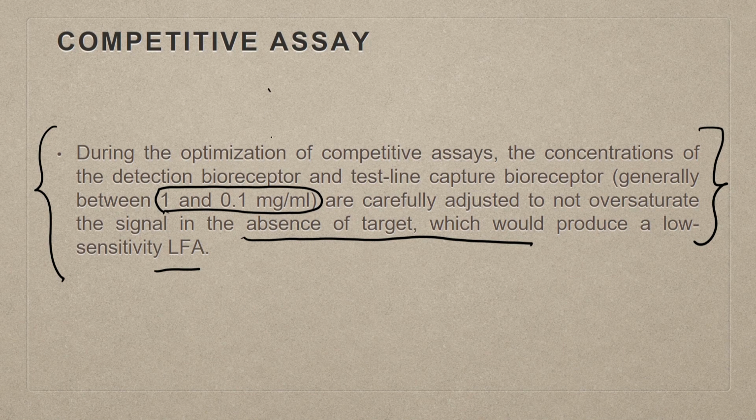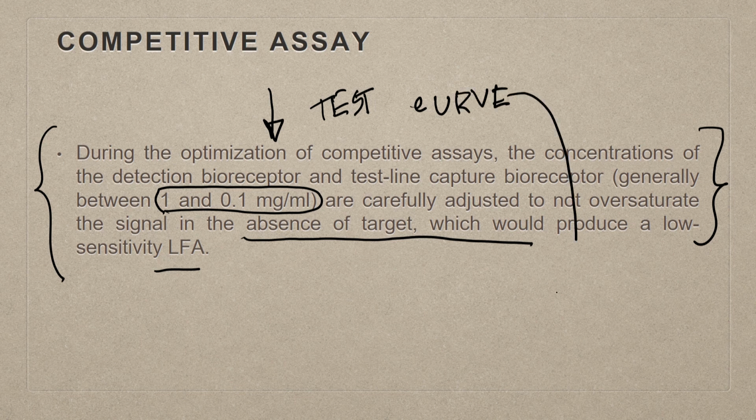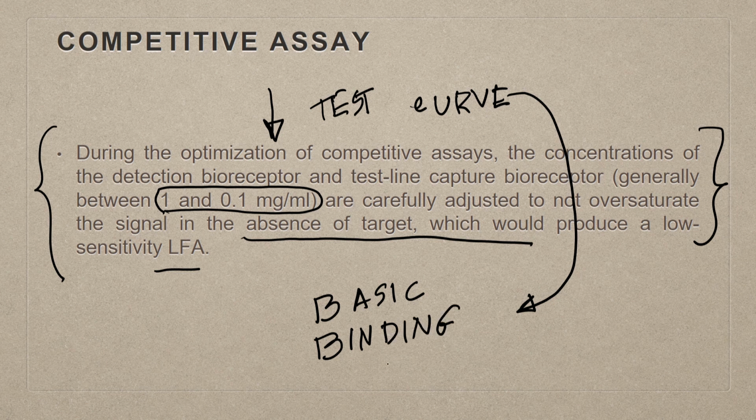Okay. So in order to achieve that, initially test curves have to be developed. In other words, these test curves will take care of the basic binding kinetics.